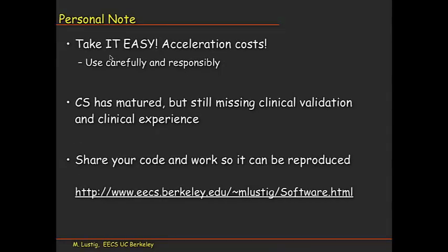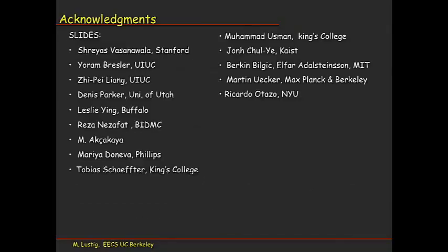Personal note, take it easy, really. Acceleration does cost, and it costs in the SNR. So use carefully and responsibly. There's a lot of need for clinical validation, and I urge the vendors to give packages with implementation so people can actually try. Share your code so works can be reproduced, and our code is shared on my page.